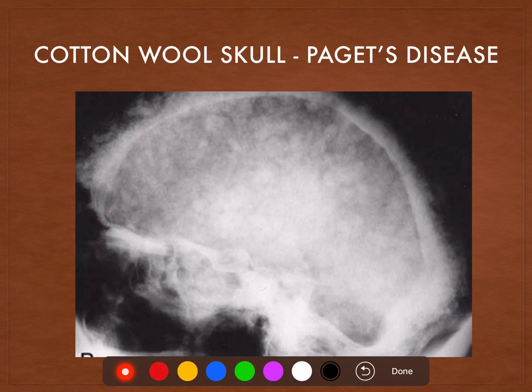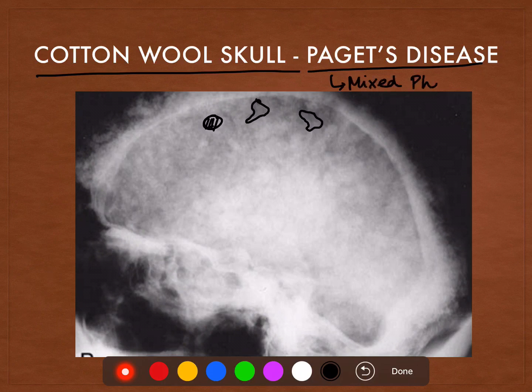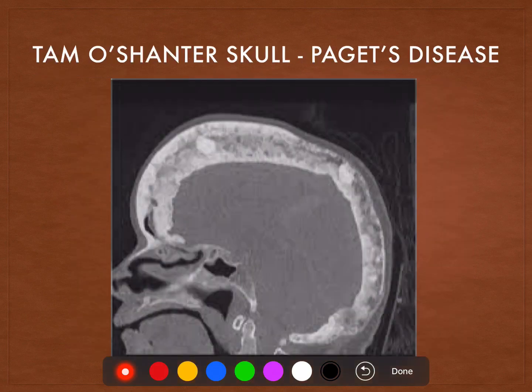In the next skull, we see multiple white sclerotic lesions as well as lucent areas interspersed within these sclerotic lesions. This skull has both sclerotic and lytic lesions and is known as the cotton wool skull, which is characteristic of the mixed phase of Paget's disease — that is, both lytic and sclerotic lesions.